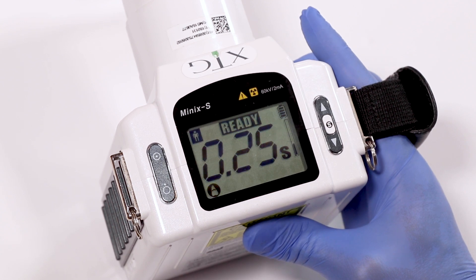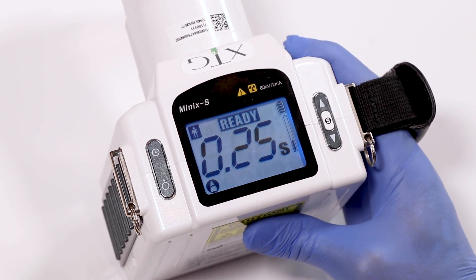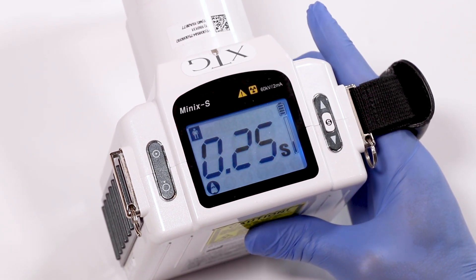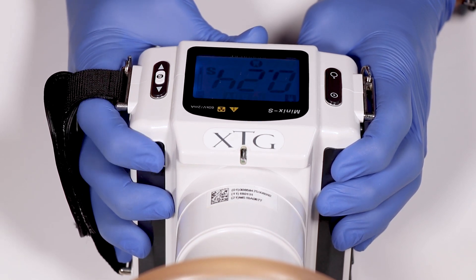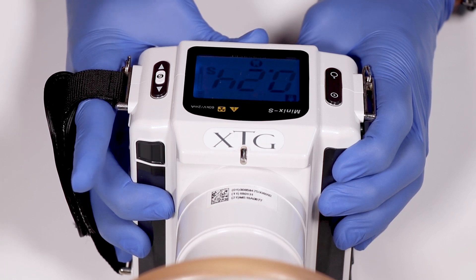Exposing an x-ray. The XTG has a two-step exposure button that has a safety that unlocks for five seconds. To unlock, just press and release the button. To take an x-ray, press and hold the exposure button until the system completes the series of beeps.